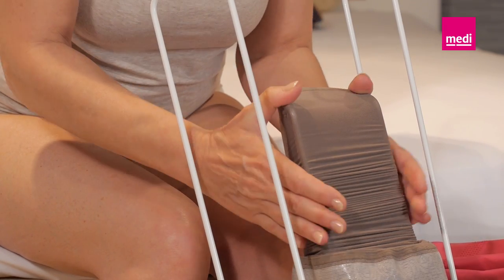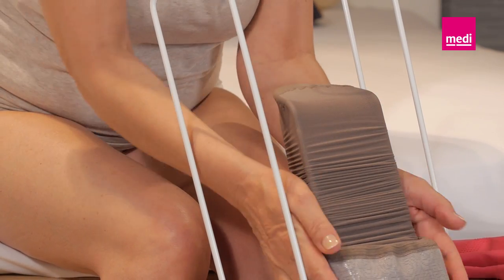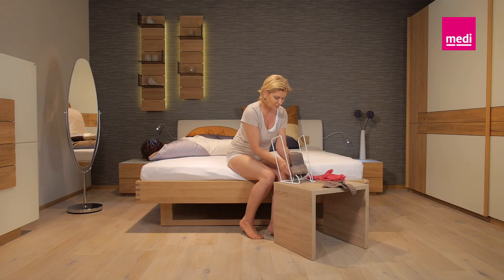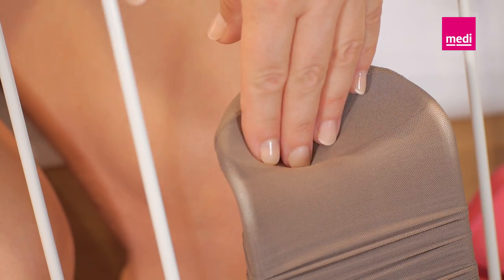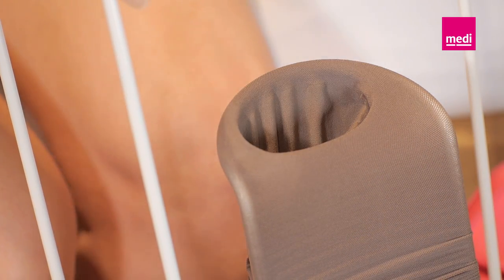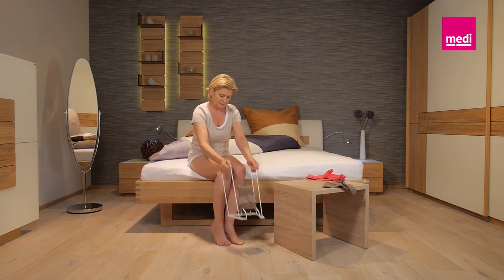Push the material back up again a little to spread it evenly. With thigh-length stockings, turn the top band over once more so you can see the outside of the top band. Now, push the toe of the stocking a hand's breadth back into the stocking. To do this, push your fingers down into the toe of the stocking to the back of your hand.